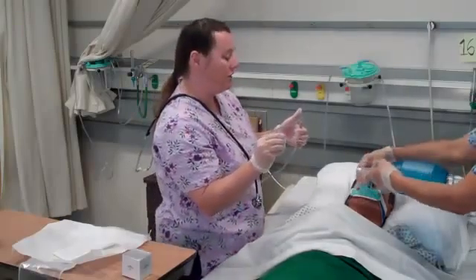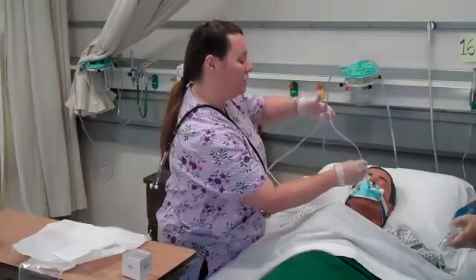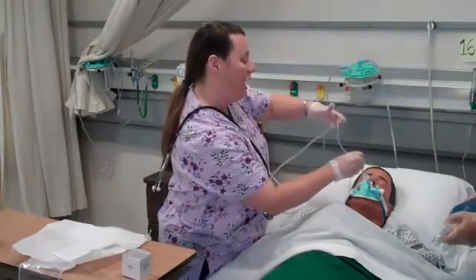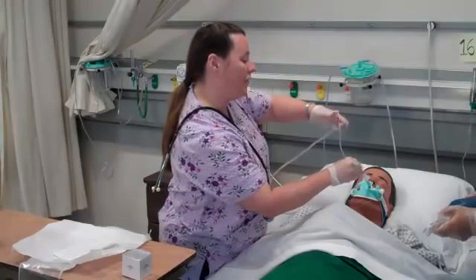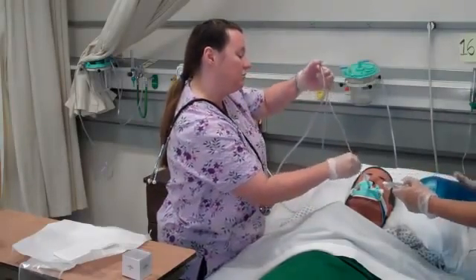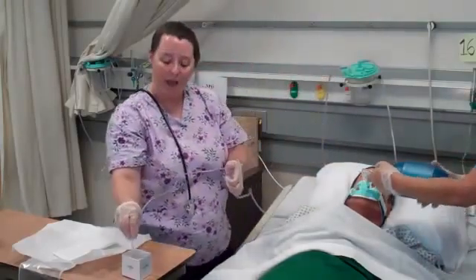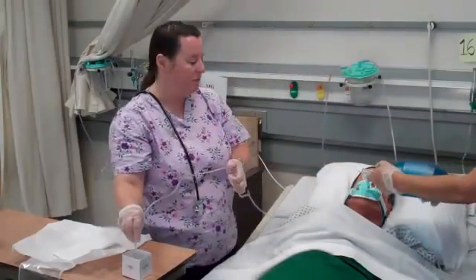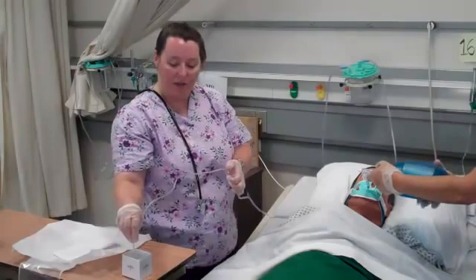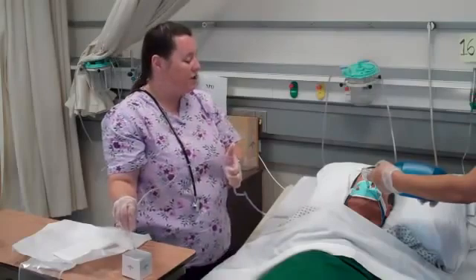The patient is removed from the oxygen source again. I go down again using sterile technique, not touching the tube to my hand. I hit resistance and the patient starts to cough — I pull up a centimeter and apply intermittent suction as I pull the tubing out, twisting and turning as I come out. I clear my tubing again and supplemental oxygen is being applied.